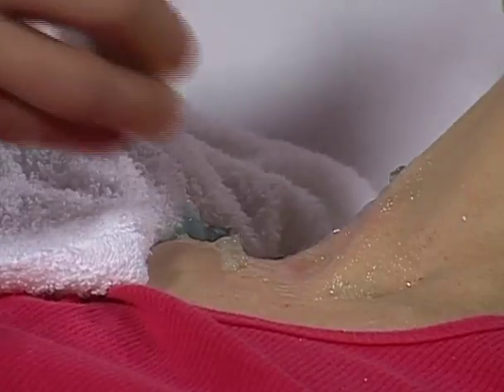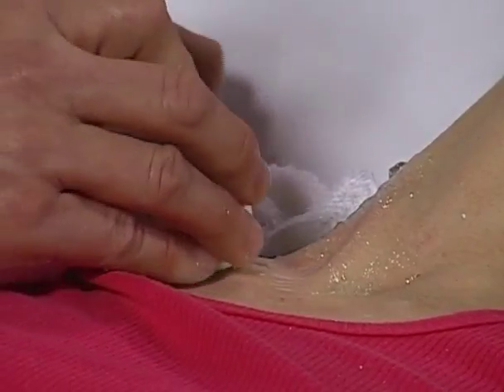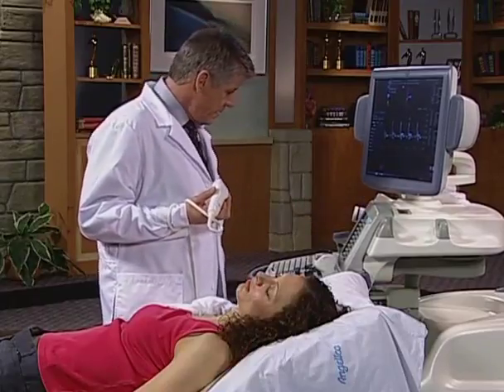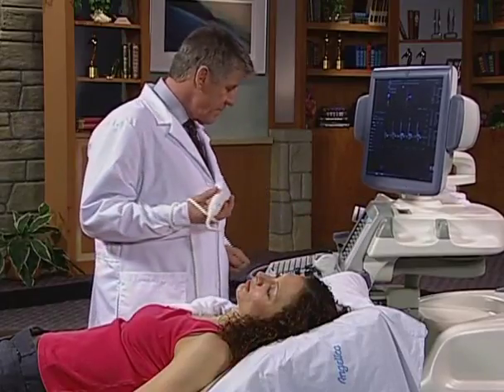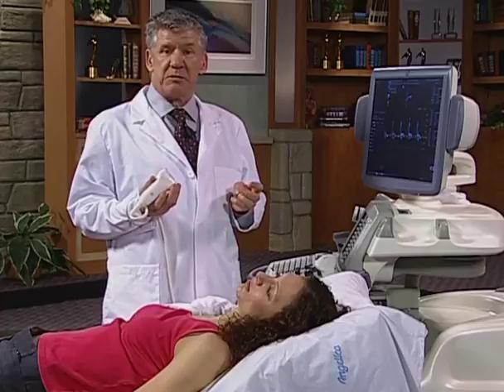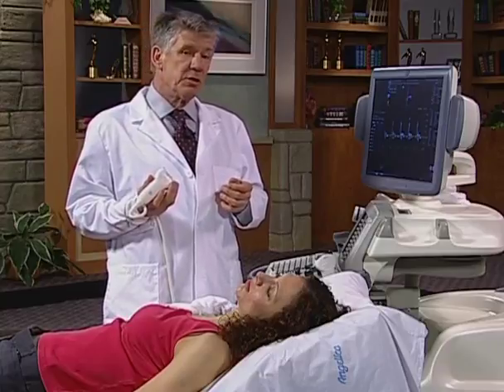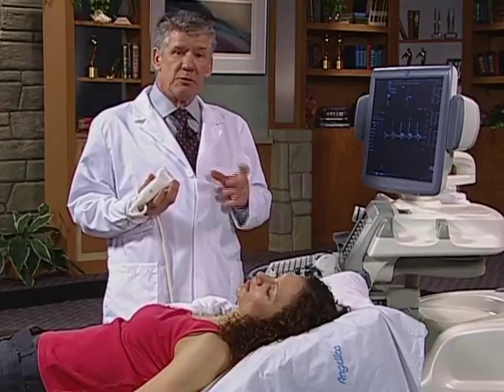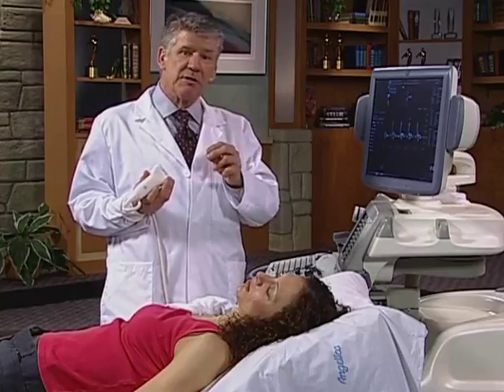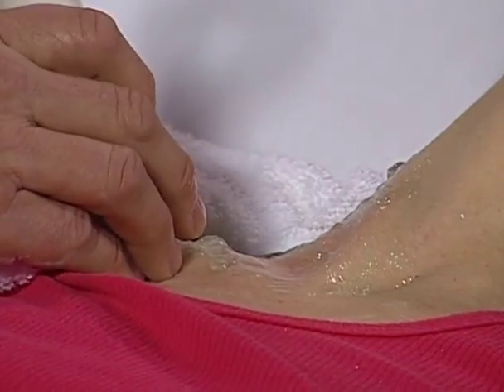So I'm going to move the transducer over the top of the clavicle, and then we'll scan in an infraclavicular position and try to identify the subclavian artery in transverse view. Then we'll pick it up from there and follow it on down. Right in this region around the clavicle, another thing we should be looking for, particularly in patients who may have been symptomatic for digital emboli or thromboemboli, is a subclavian artery aneurysm. These are pretty unusual, but if they do exist, most often they're in the region of the clavicle. So we try to pick these up in the supraclavicular and infraclavicular regions, and that is part of our routine diagnostic exam of the upper extremities.